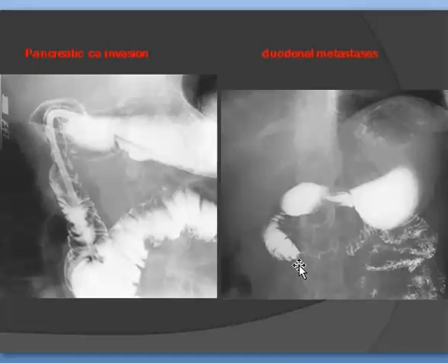Subserosal deposits of the duodenum can again impress on the duodenal mucosa, causing narrowing, but here multiple segments of narrowing are seen here and there, denoting subserosal deposits. Usually such an appearance comes from breast or from bronchogenic carcinoma. Don't forget bronchogenic carcinoma as a cause of any abdominal metastasis.